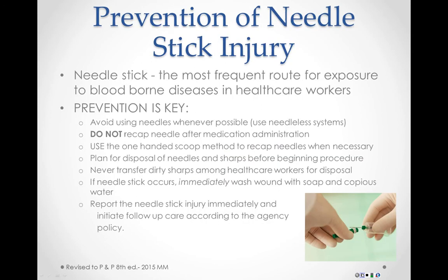Needle stick injuries are a serious safety hazard associated with injections that can expose the nurse to blood-borne diseases such as HIV and hepatitis. Prevention is key. Avoid using needles when effective needleless systems or safety needles are available. A safety needle is one that is engineered to prevent needle stick injury, such as needles with a protective sheath or a plastic guard attached. It is not practical to supply these types of sharps in the nursing resource lab, so please discuss the use of safety needles with your clinical instructor in the hospital setting before you use them.